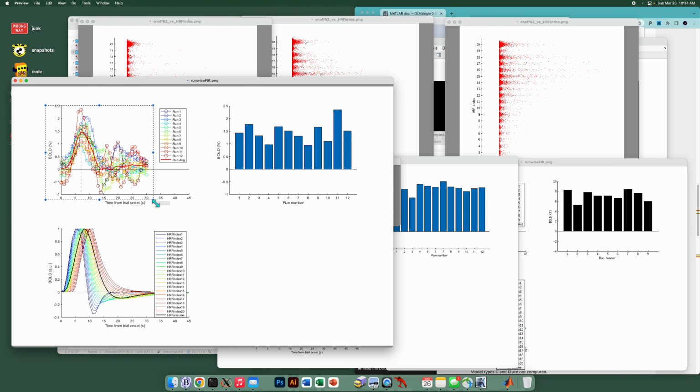This is critical because this gives us a deep look into the actual time courses going on in the data set. And it's critical because if you get the HRF wrong, and drastically wrong, you might completely corrupt the analysis. And so by looking at these plots and comparing them to the library that GLMsingle eventually uses, remember this is just a very preliminary diagnostic analysis, but as you can see, there's a very good correspondence here, and we can be pretty confident that the library is going to accurately match the time courses that are present in the data set.